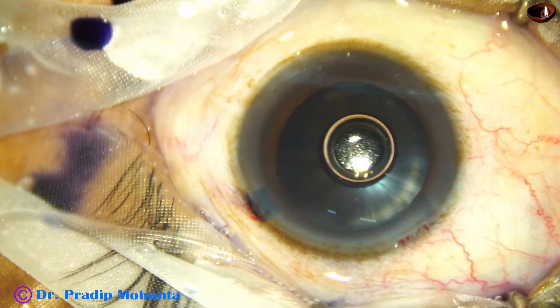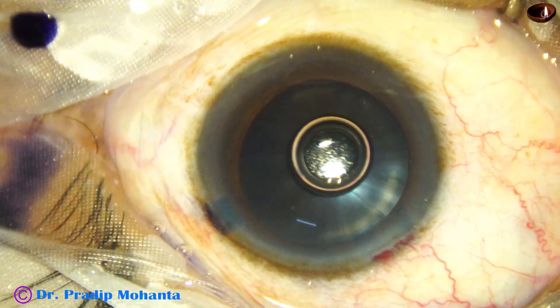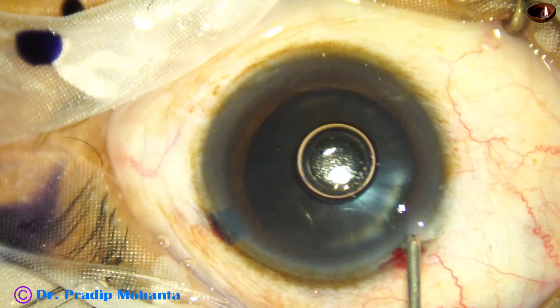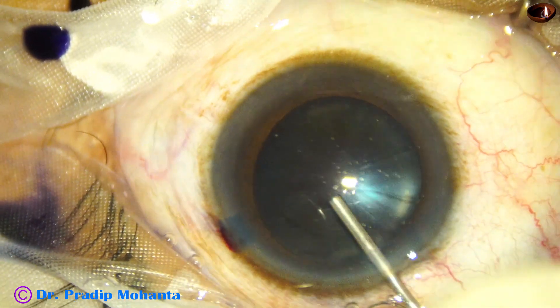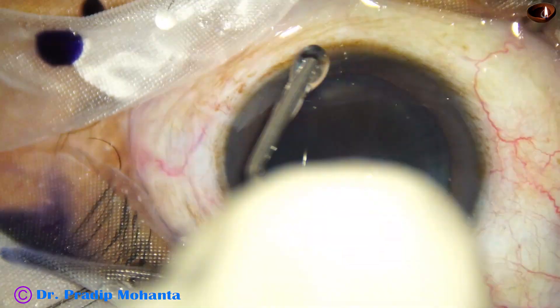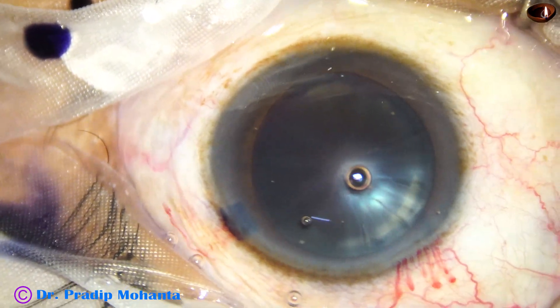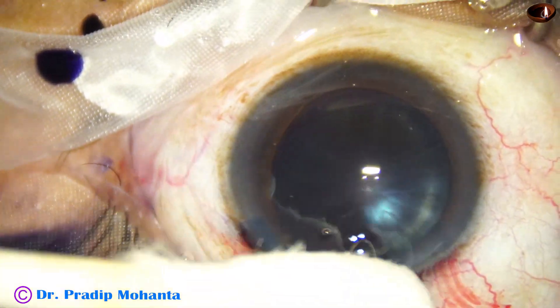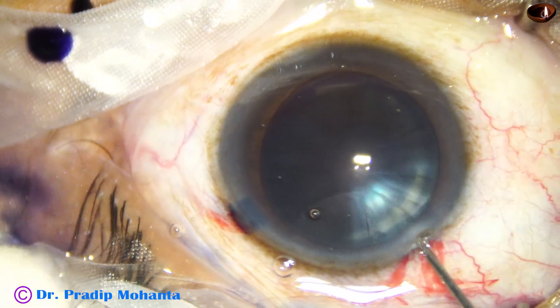Now is the time to fill the anterior chamber with viscoelastic, and I am going to use 2% hydroxypropyl methyl cellulose. Methyl cellulose is applied over the cornea for better visibility, and now I am going to do the capsulorrhexis.